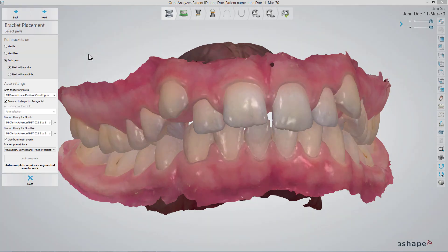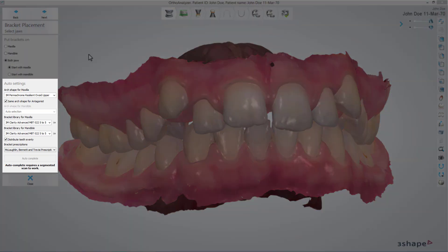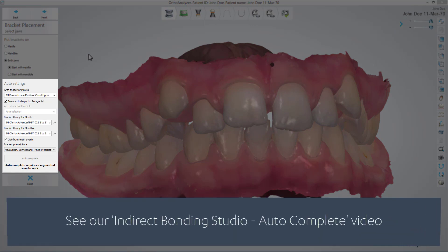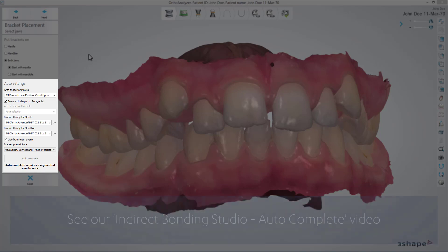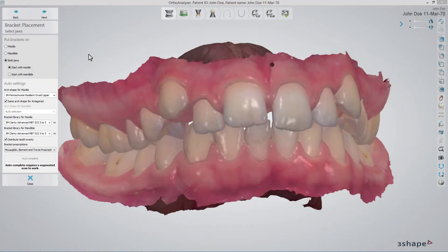It is worth knowing that OrthoSystem enables you to perform an auto-complete workflow too. Please watch our video for more details. When you have finished in this step, click Next.